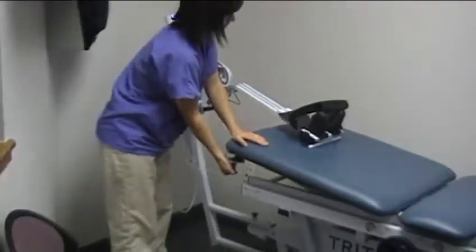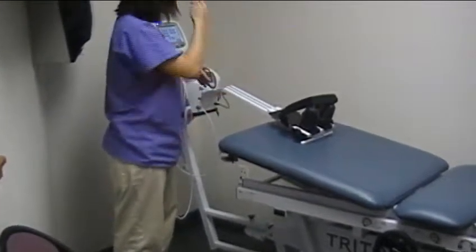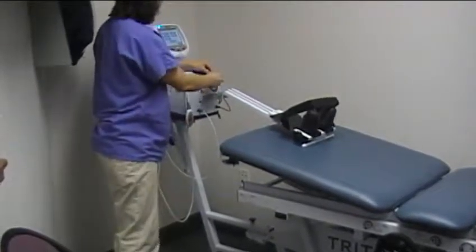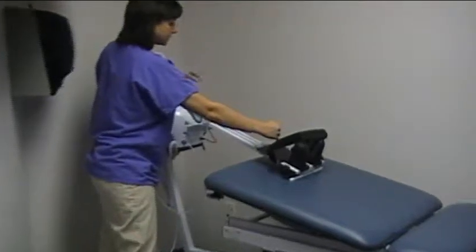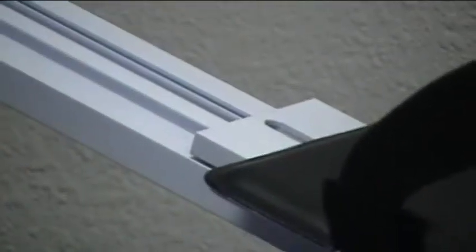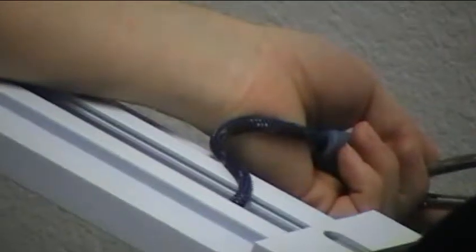What you want to do is lift up this bottom part down here to begin the cervical decompression on the patient. You also want to grab the rope and connect it to the distraction unit.